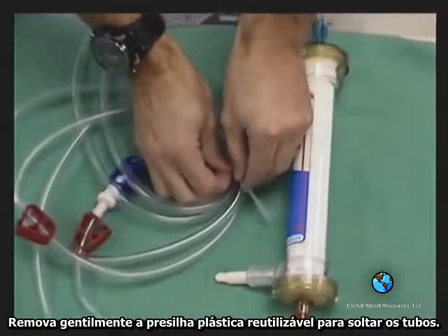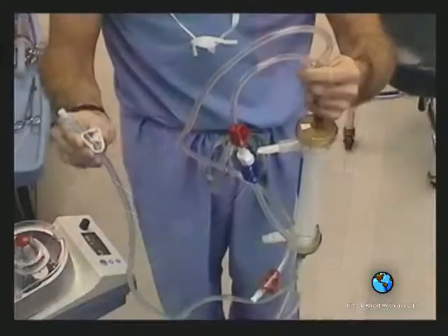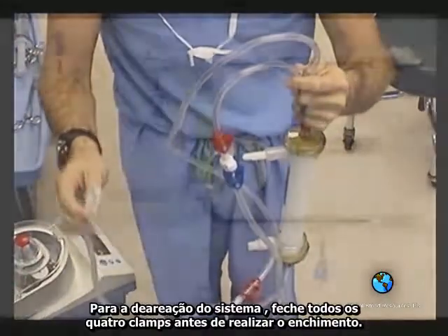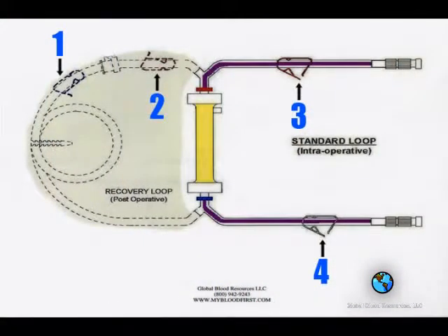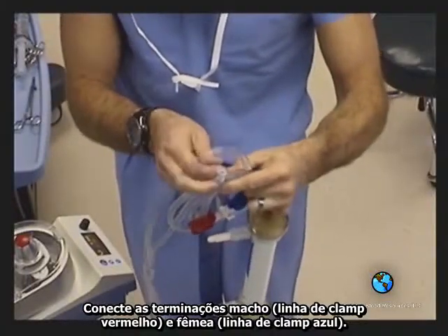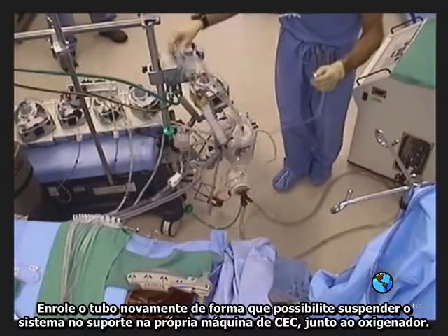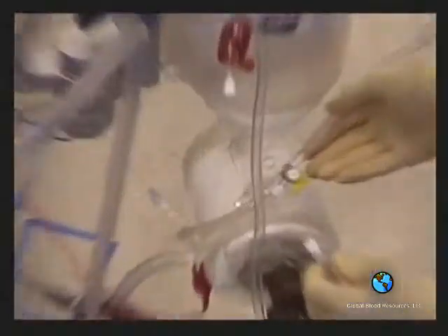Remove the reusable tie band by placing your thumb behind the tab and pulling it apart. Close off all 4 pinch clamps before priming. Recoil and tie together the recovery loop of the tubing set using the reusable tie band. Hang the tubing set on your primed pump.